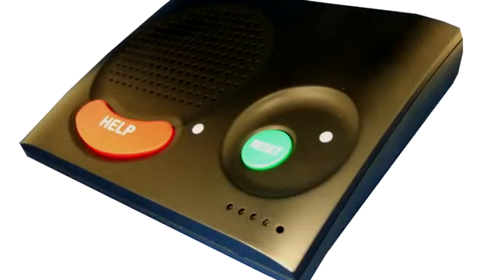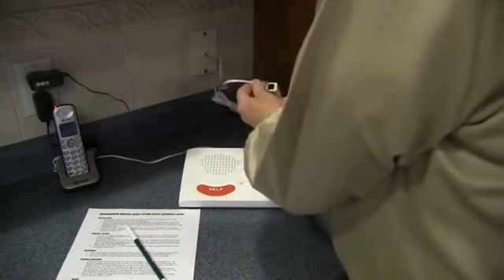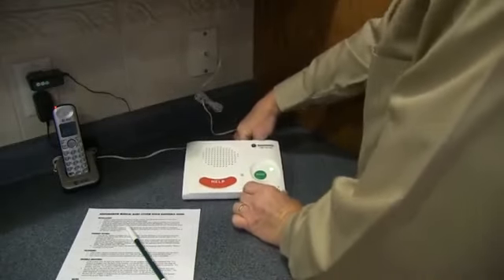If a standard analog telephone line is not available, ResponseNow does have a wireless option available. If you are using a computer in your home and access the internet through the phone line, you may have a DSL phone line. If so, you should plug a DSL filter between the phone jack where you place the ResponseNow Medical Alert System and the console. Place the phone cord coming from the wall jack into the DSL filter and plug the filter into the back of the medical alarm into the port marked line. If you do not have a DSL filter, you can get one from your phone service provider.